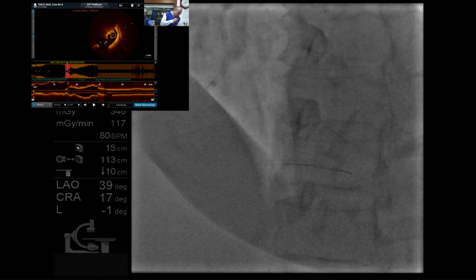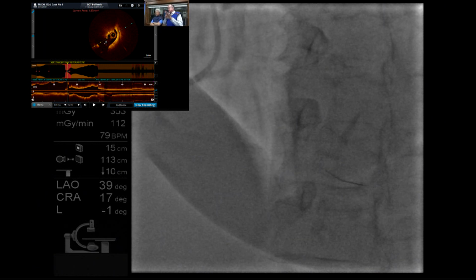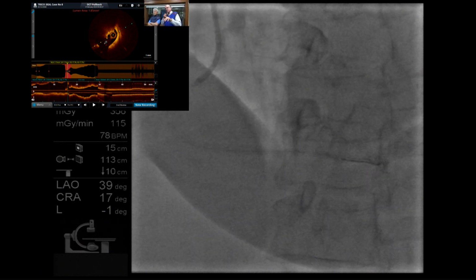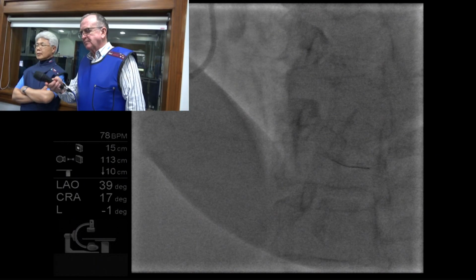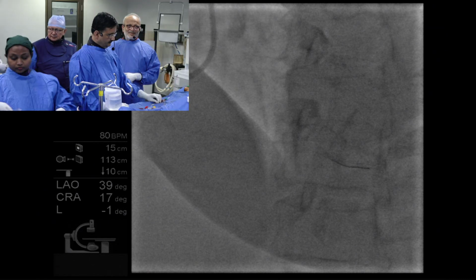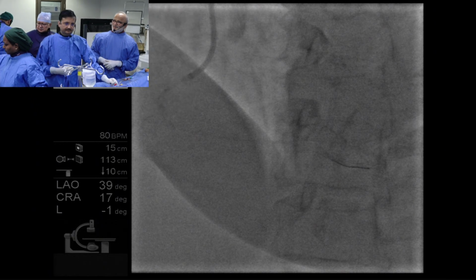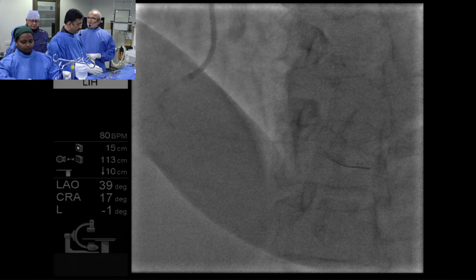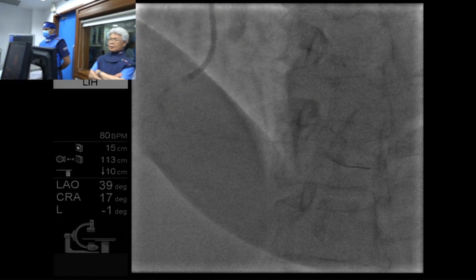I think another question here: we're talking about rotablator in the right coronary artery. Are we going to be using any drug therapy here, aminophylline? Do you ever use a pacing wire? Maybe comments from the panel. Rota wire, floppy. Pardon? Pacing wire. Or aminophylline, anything? No. So no aminophylline, no pacing wire? No. So how do you avoid the bradycardias, and what's your technique?